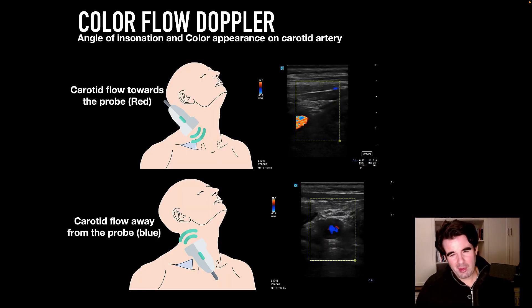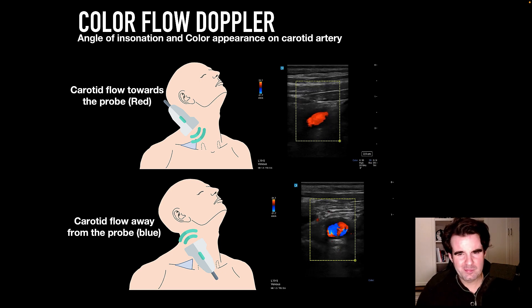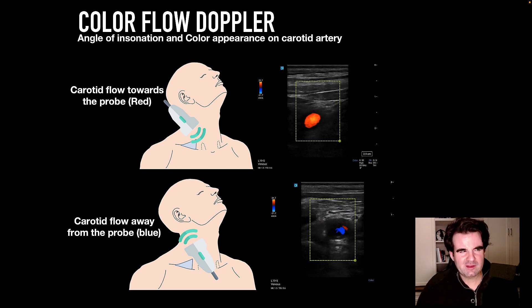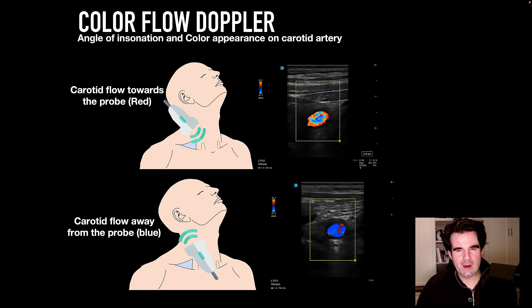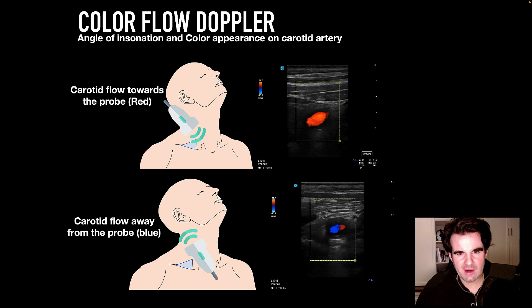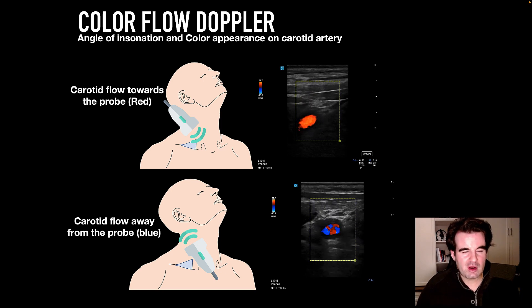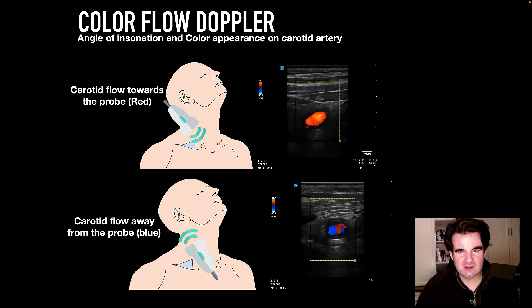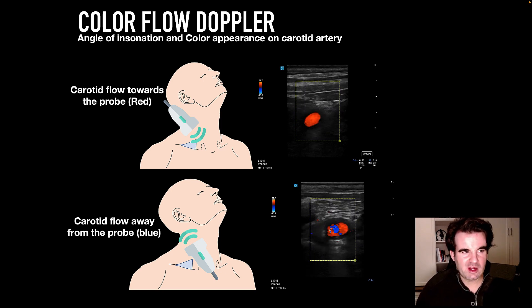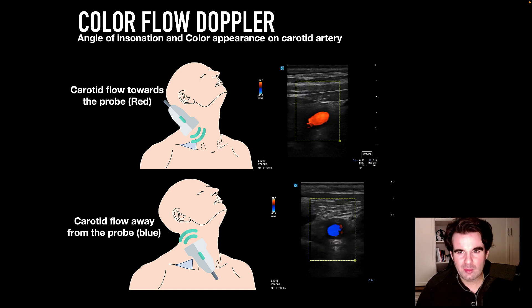You're probably thinking it probably depends on the direction of the probe — this whole blue away, red towards concept. So in the carotid artery, depending on where that probe is positioned, you can make the arterial flow look red or blue.